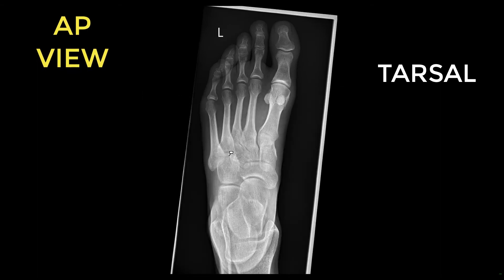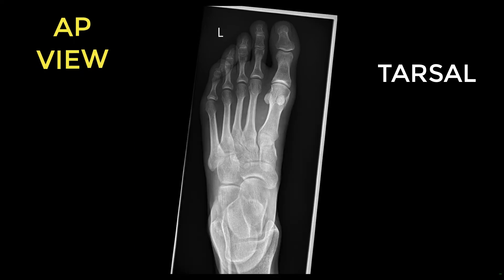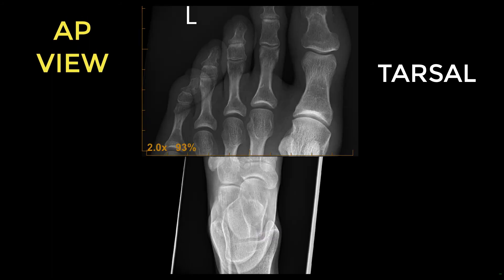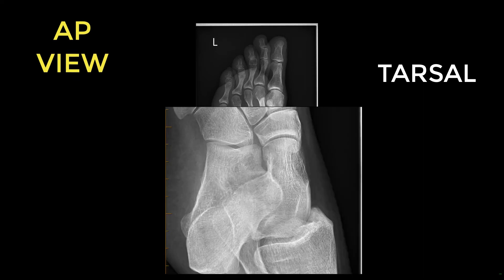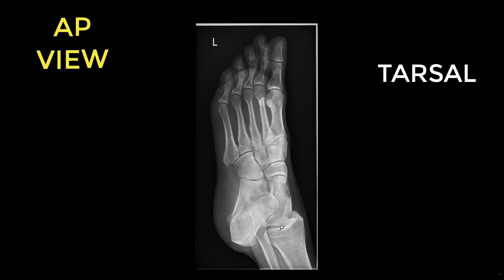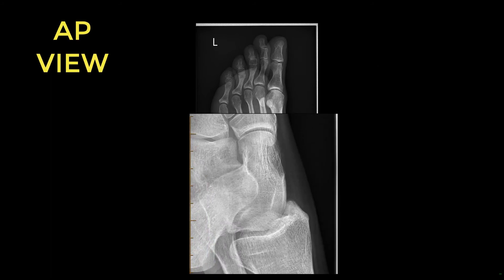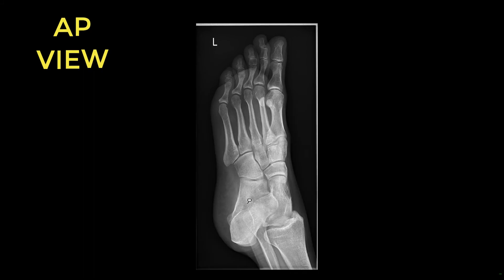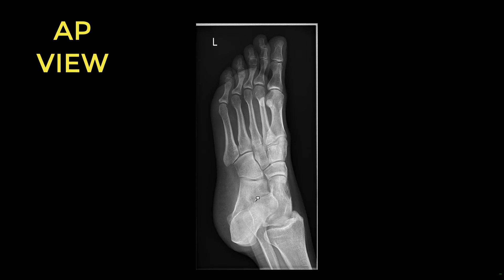Coming more proximally, you reach the tarsal bones. These are best seen on the oblique view. Right next to the ankle joint — where the tibia bone is — is the talus. Next to the talus is the calcaneum bone, so the talus and calcaneum are the most proximal tarsal bones.